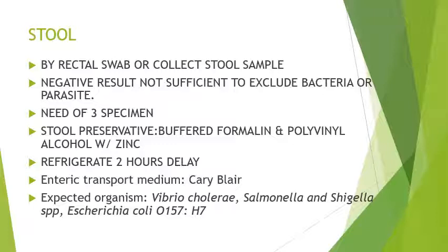Ibig sabihin, kung nag-negative siya dun sa stool culture, then hindi ibig sabihin nun na wala talaga siyang bacteria o parasite. He or she does not have the bacteria or parasite. Note, there is a need of 3 consecutive specimens. 3 specimen ang kailangan, kasi possible na sa first negative, sa second positive, tapos sa third negative. So at least there is a ruling kung para makuha natin yung positive result.